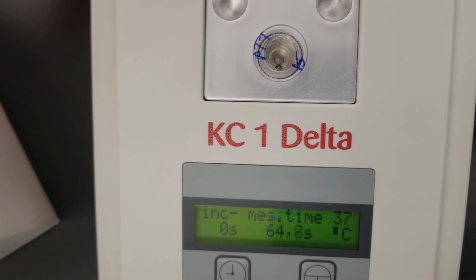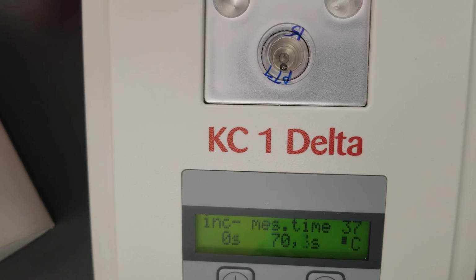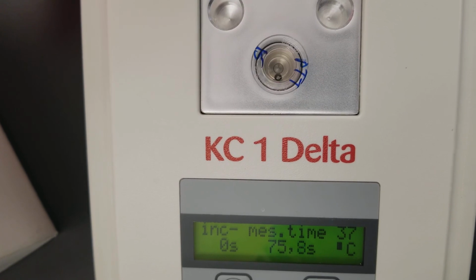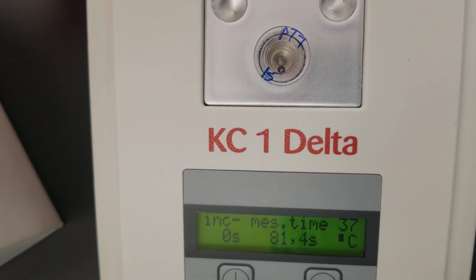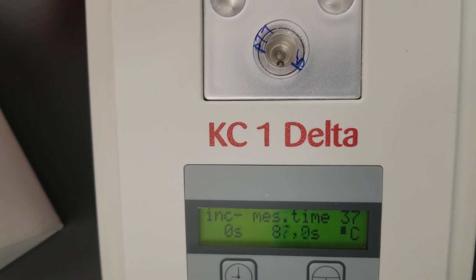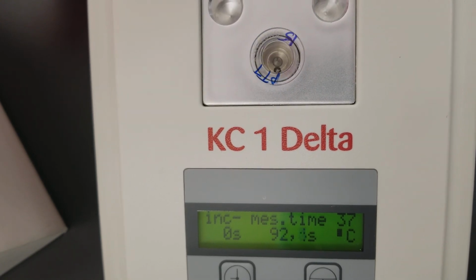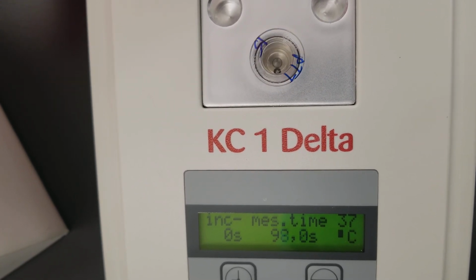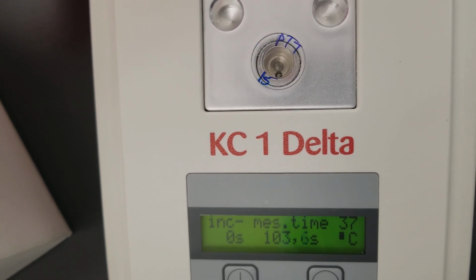Oh man. Well, they're both going to be high then. Your normal is going to be around 20. These are obviously not normal. Again, they're old, so the accuracy is not going to be really great, and we're expecting it to be high like this. Oh, maybe we're going to get a critical. Let's see. Looks that way. Okay, so this is definitely a critical.